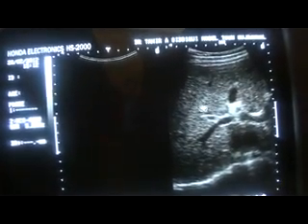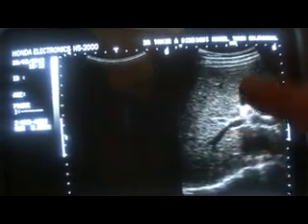This is the liver. The outer surface is irregular. Gallbladder wall thickness appears more thick than normal. Echogenicity — ecobrightness is raised. The texture is coarse; it's not the same everywhere. And the periportal areas are slightly less echogenic than that of the normal.